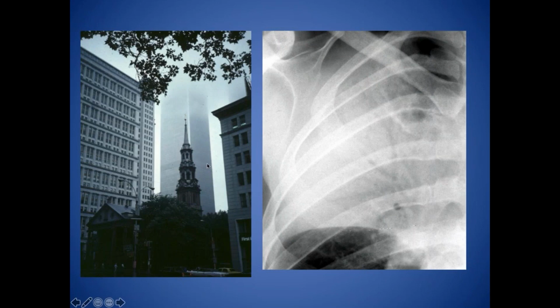Why am I showing the image of the World Trade Center? Well, in 1986, as a medical student, I was walking down Manhattan and I took this photograph on a summer's day. If you like, the blood vessel is represented by the skyscraper, and the mist that descends over the skyscraper obscures the blood vessel. And this is the basis of consolidation. When you get to the situation where you've got dense consolidation but a patent bronchus, you can then see the bronchogram. Here is the interface of the horizontal fissure, thereby diagnosing a right upper lobe pneumonia.